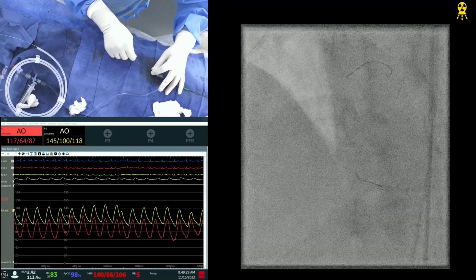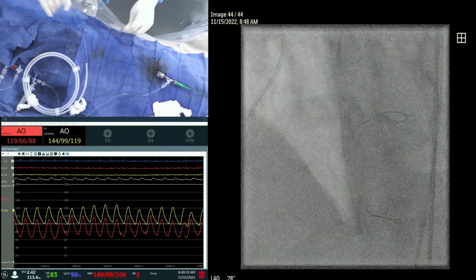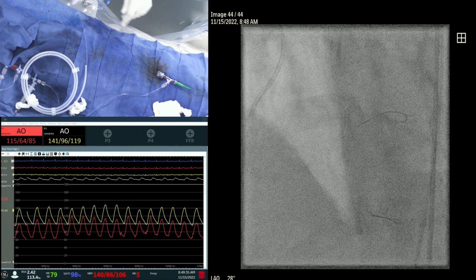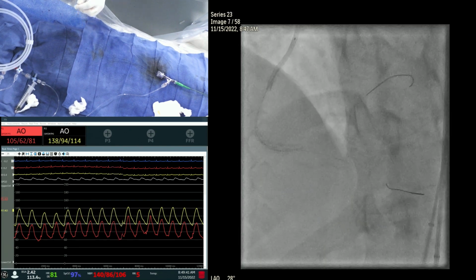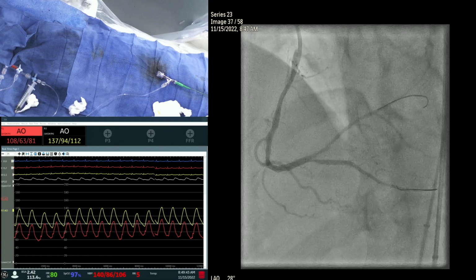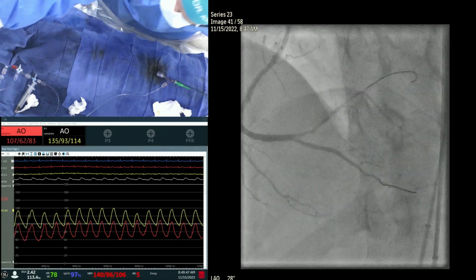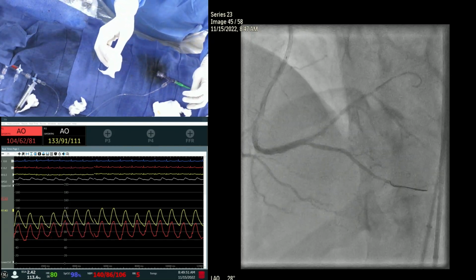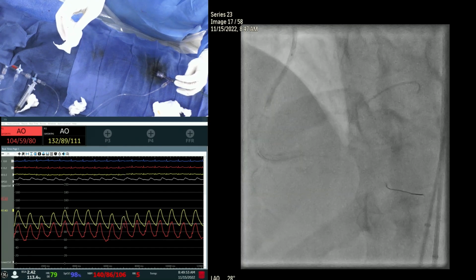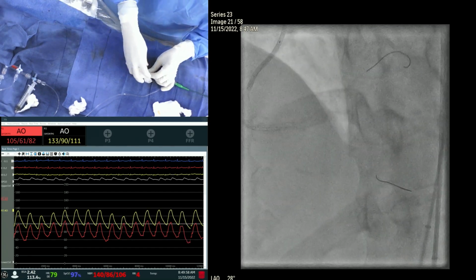There's an expert CTO paper on expert CTO and the time required to cross the lesion. So now our idea is that the AV continuation PDA is more important. You saw that big vessel. Right, Samir? So we're doing a balloon of the AV continuation as a provisional. If need be, we'll go through it and do the reverse crush. So right now we are doing a nice balloon dilatation of the AV continuation. Hold the wire. See it very nicely. Yeah, big PDA.